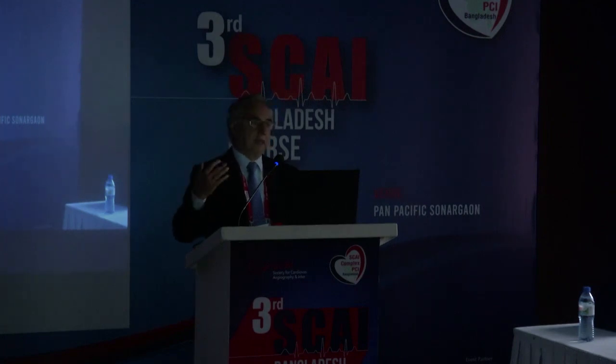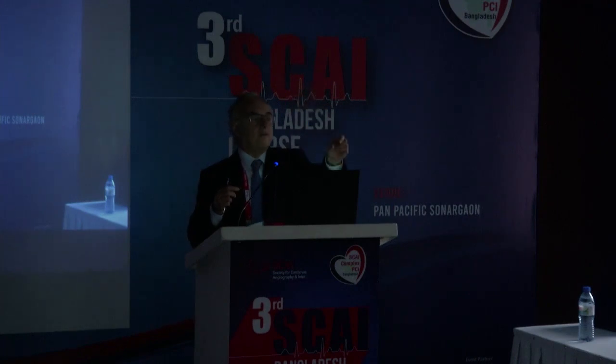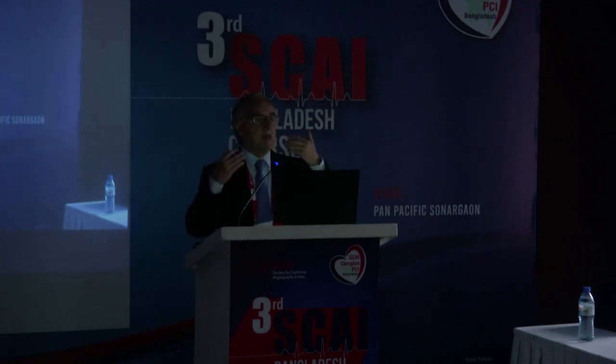And in non-left main, you will have more challenges than in left main bifurcation, because again, left main is a 4 millimeter vessel with a 3 and a 2.5 millimeter vessel, whereas in a non-left main, you have a 2.5 millimeter vessel with a 2 and a 1.5 millimeter vessel. So you are going to have much more metal and much more instruments, hardware is what we call it, in a much smaller space, okay?